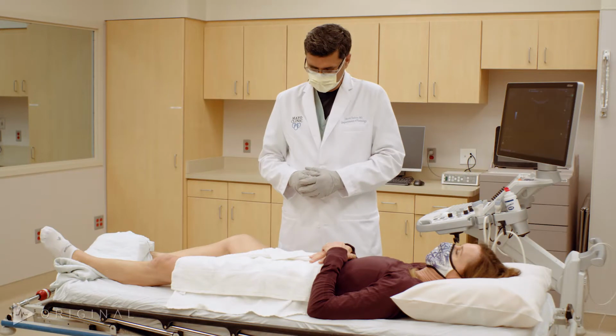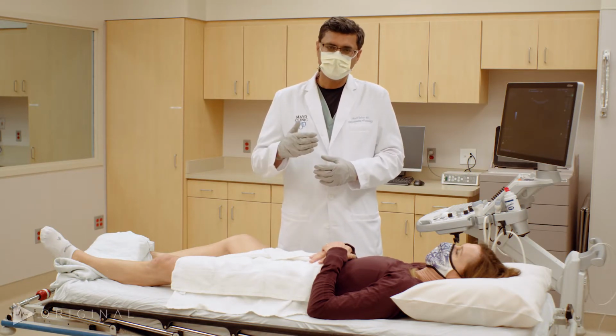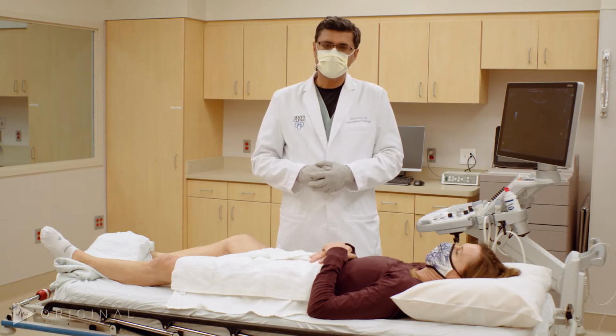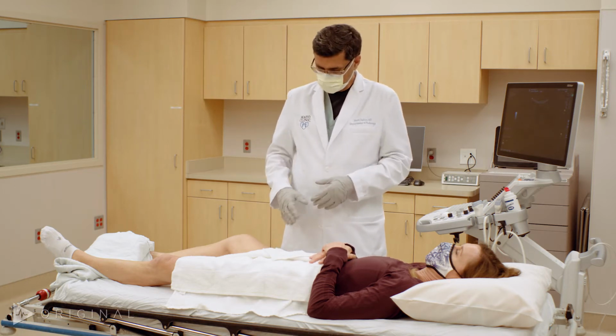Whenever we do the hip joint, it has multiple components. You can divide it between a medial, anterior, lateral, and posterior evaluation. Given the amount of time we have today, we will concentrate on just trying to get the anterior and the lateral aspect of the hip, and the demonstration will be limited to those. Usually we start with the anterior side.